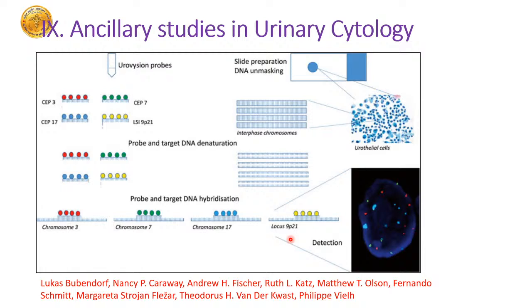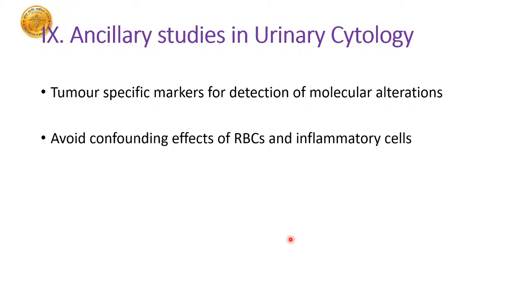So this tests for all of these; it's a multi-probe assay. Please remember, we have UroVysion for those cases which we call atypical urothelial cells. Next slide, please.